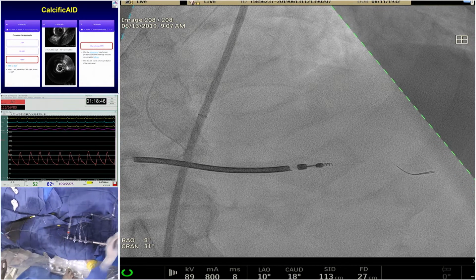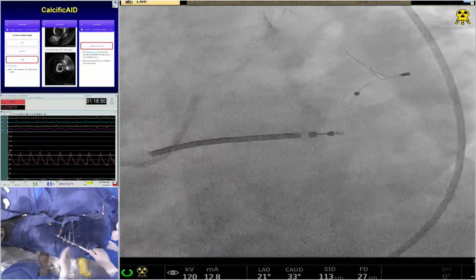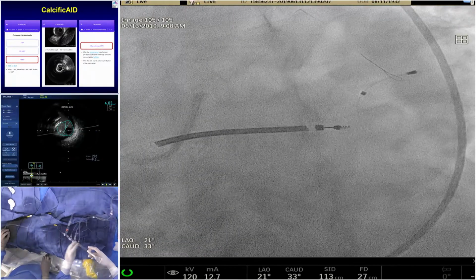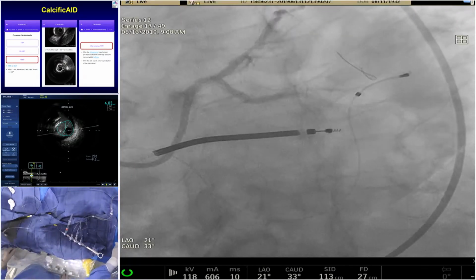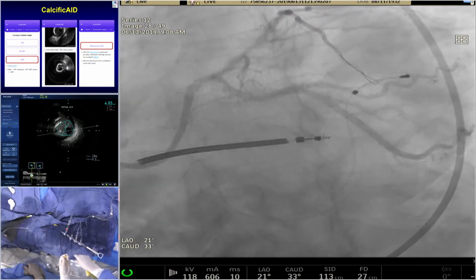And IVUS of the ostium of the circ. I think she did. No, we did. She showed it to you. The IVUS of the ostium of the circ was 4.0. Okay. Show the IVUS again, please, of the ostial circ. Okay, ready? I always like to see after burring what's going on with that circ. In a good spider, you really do not see the ostial circ. Looking at this, probably I will go for circ first.